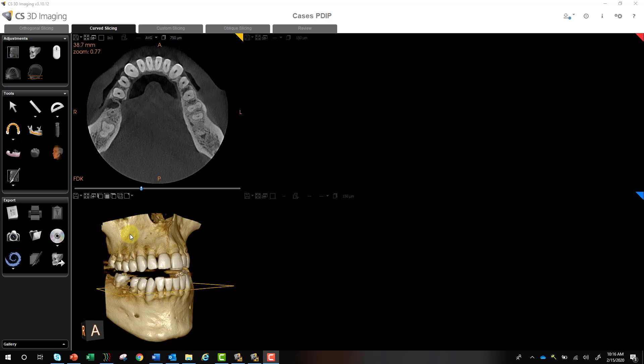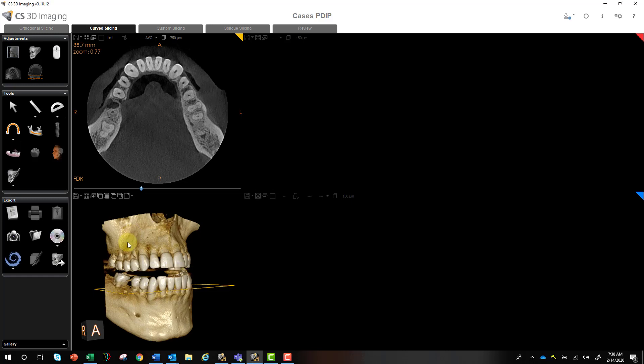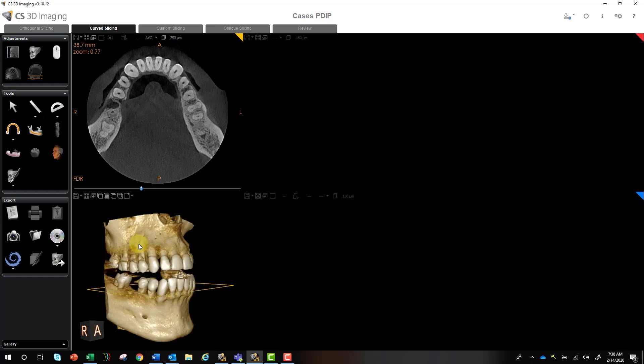Hey everybody, this is Phil, and this tutorial will cover creating your panoramic curve and mapping your nerve. First and foremost, we want to map our panoramic curve.